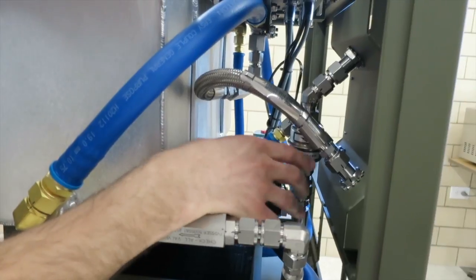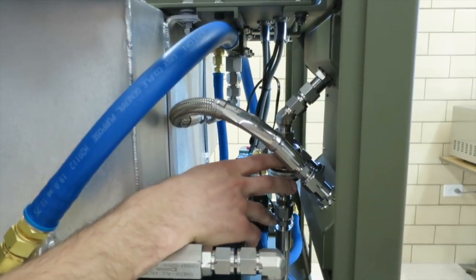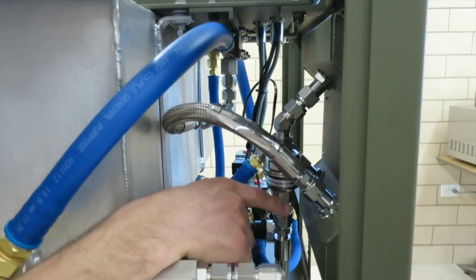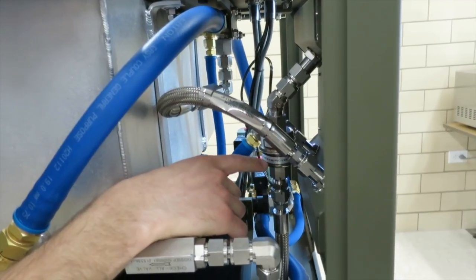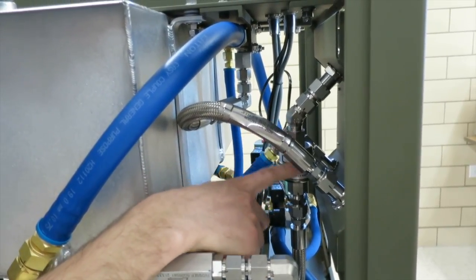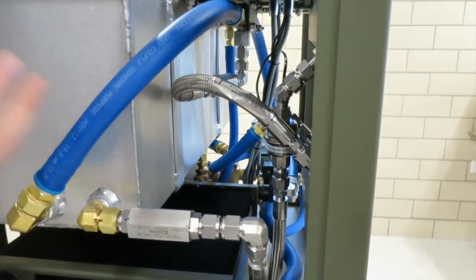The steam trap is very critical to the operation of the sterilizer. During a cycle, when steam forms in the chamber, it will seal off a bellows in the steam trap so it can build pressure. But as condensation forms during the cycle, it will cool off the steam trap, open the bellows, and allow condensation to flow through this hose back into the tank. So that's how it reclaims the water.